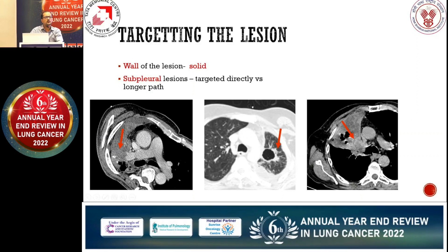We need to see the bronchus cut off. Even here there is an endobronchial lesion, and we always need to target the central component, which would be less enhancing compared to the collapsed lung, which would be more enhancing. This needs to be targeted always. And here the patient is already on chemotherapy, with nodularity or irregularity along the cystic area, and there is some solid component.